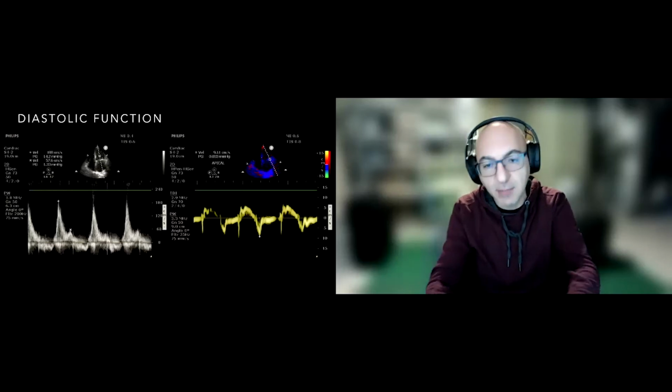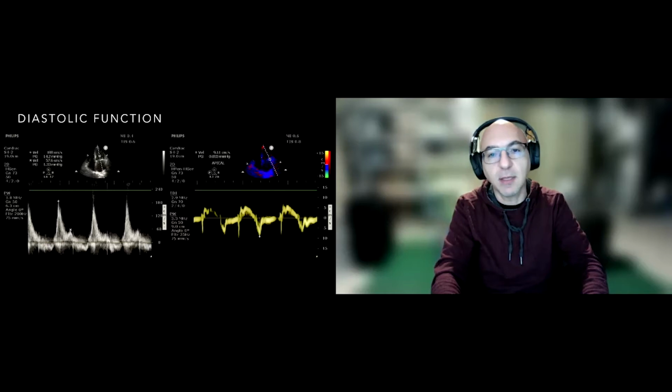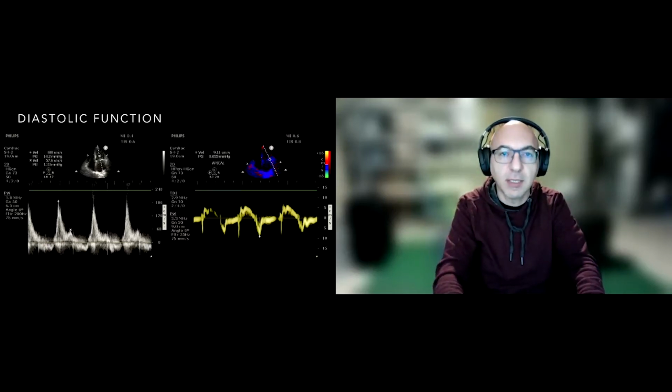So the same scenario. Let's take an influenza patient who comes in with pulmonary edema, and I know this is usually an older person who might have diastolic dysfunction. Before I hit them with a diuretic, and I already have them on CPAP, am I going to crank the pressure on CPAP and expect them to improve or not?